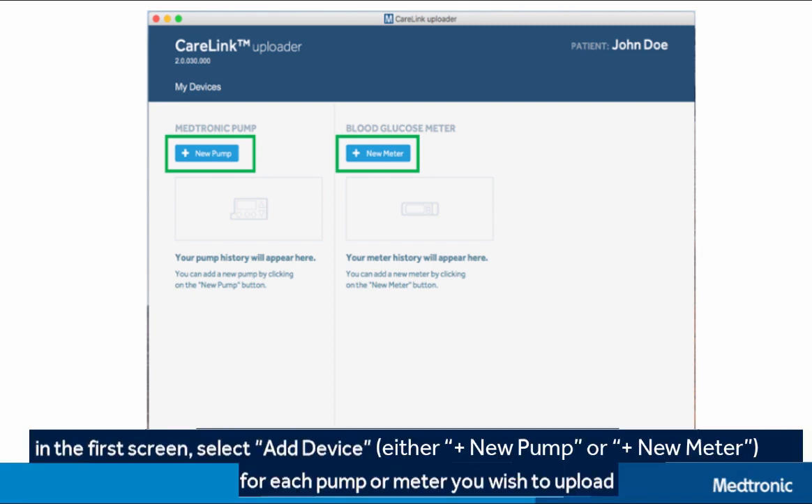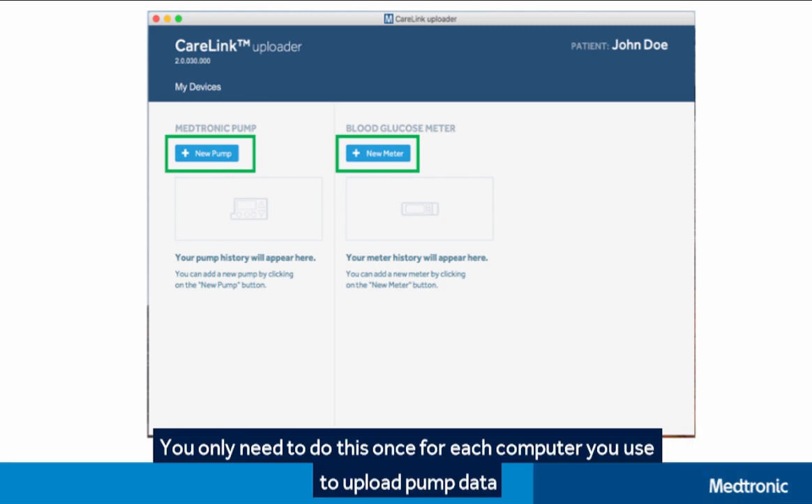On the first screen, select Add Device for each pump or meter you wish to upload. You only need to do this once for each computer you use to upload pump data.